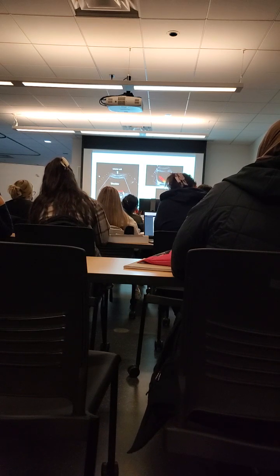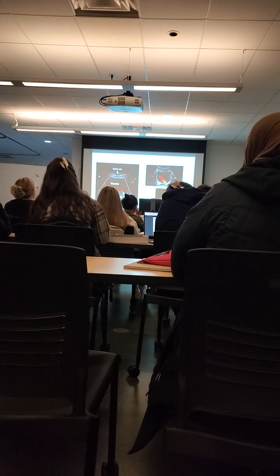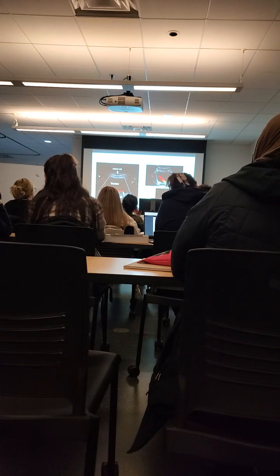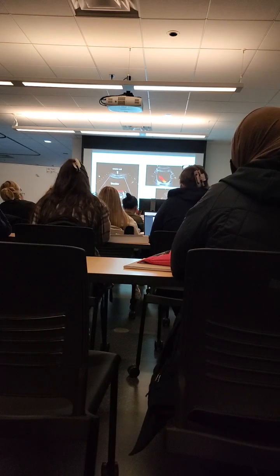And as you can see here, you can get the left and the right at the same time. Sometimes, and here again, left and right. This is the left coming out from here. This is the right. We can't see where it's coming out, but it's coming out right around here, and this one's coming out right around here.